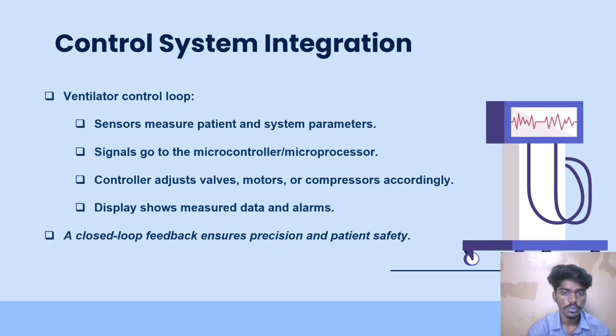The control system integration. Ventilator control loop. The sensors measure patient and system parameters. Signals go to the microcontroller and microprocessor. The display shows measured data and alarms.